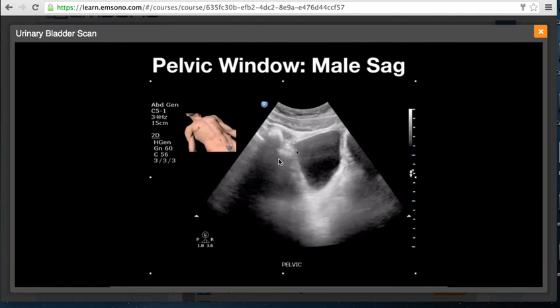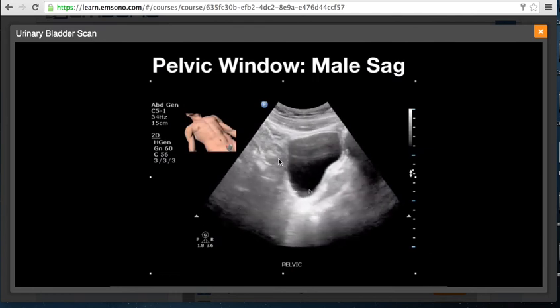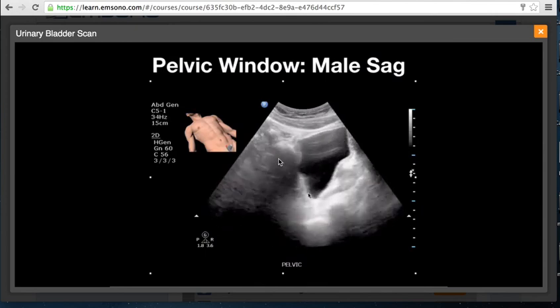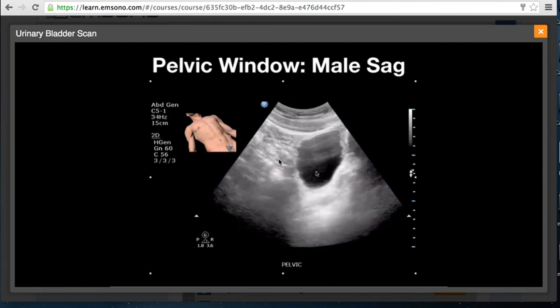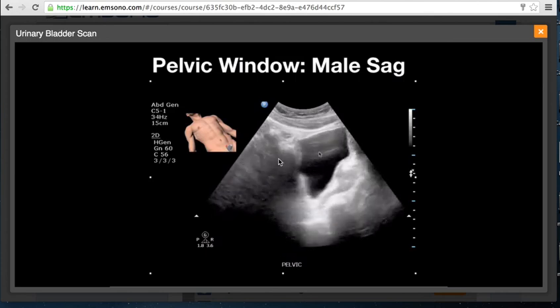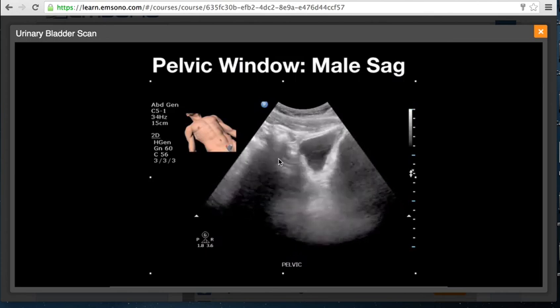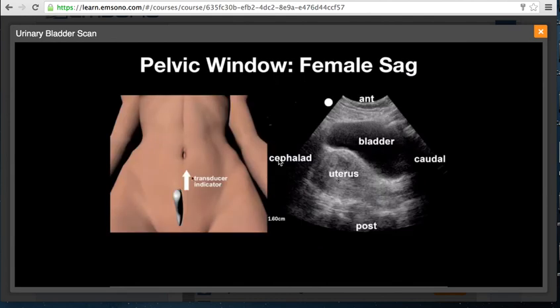Here is a sagittal sweep through the bladder going from side to side. There is an excess of gain in the far field due to posterior enhancement, so you would want to turn the gain down in the far field. Reverberation artifacts are noted in the near field. For a female patient, place the transducer low just cephalad to the pubic symphysis with the indicator toward the patient's head. This provides a view of the urinary bladder anteriorly, reverberation artifacts in the near field, the uterus posteriorly, and the cul-de-sac posterior to the uterus.